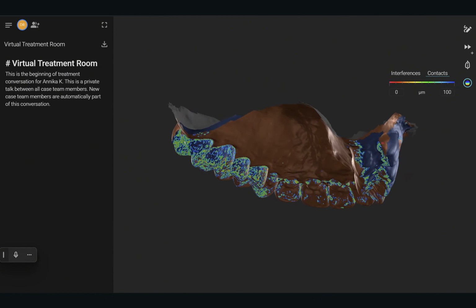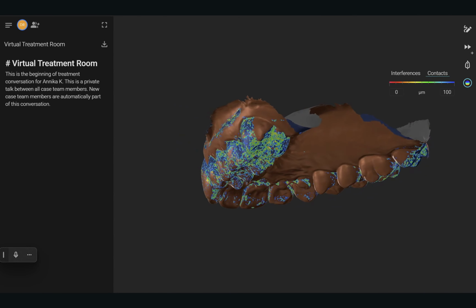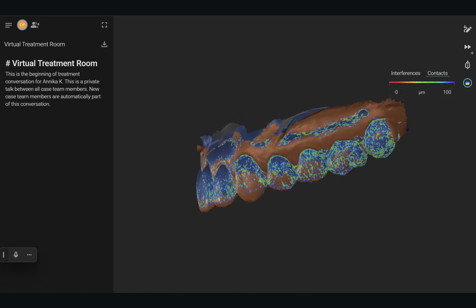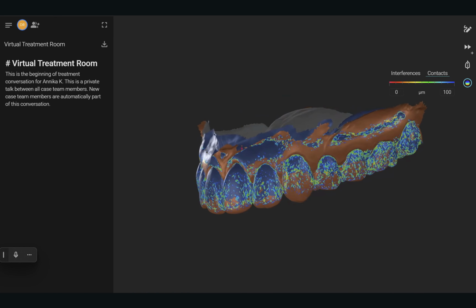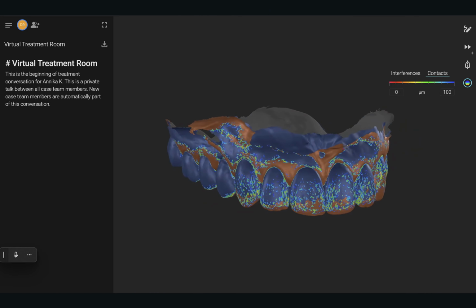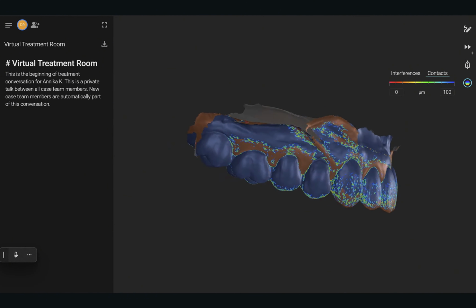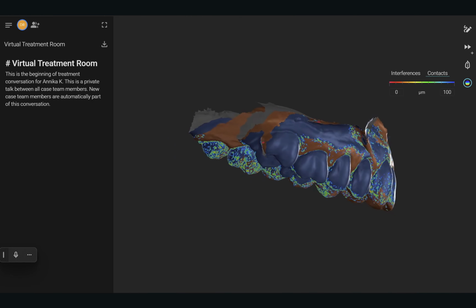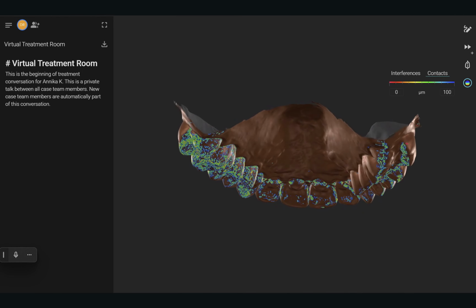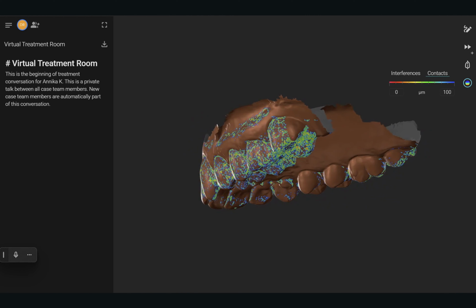This is a primary example of something you can quickly use to enhance your communication. This is a patient, and I'm sure it's a classic case for a lot of people who've had clear aligner treatment, and she was adamant that the wire wasn't working, it was flexing, that her front teeth were moving. I could tell down to the micron level that no, it was the same. It was fine.